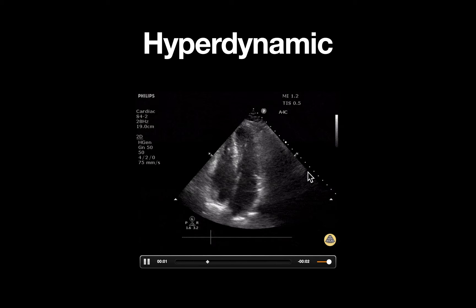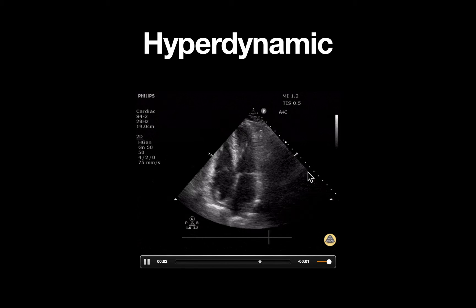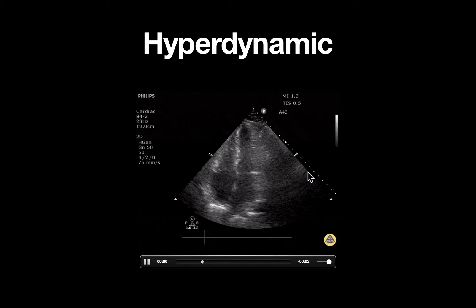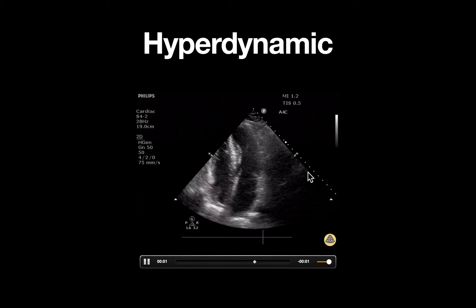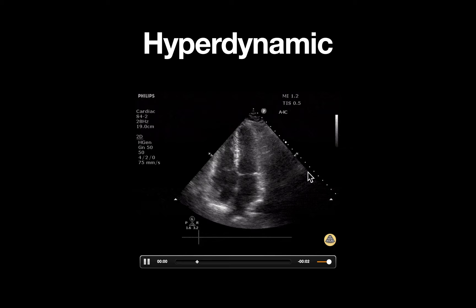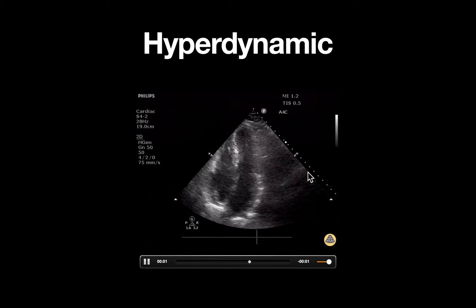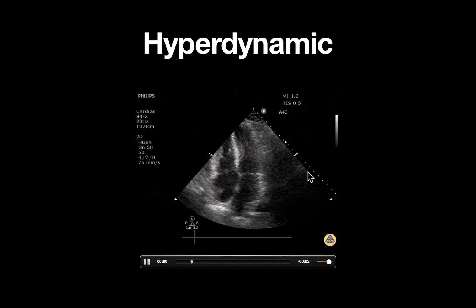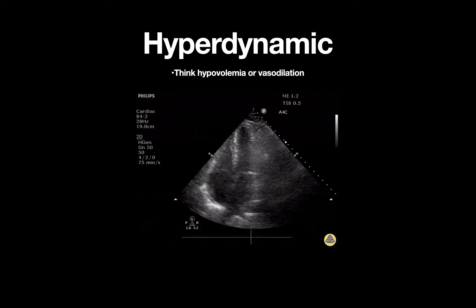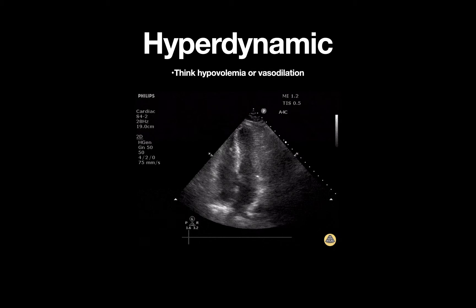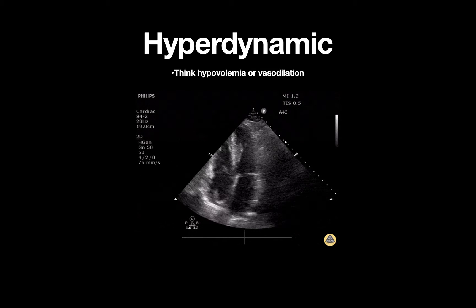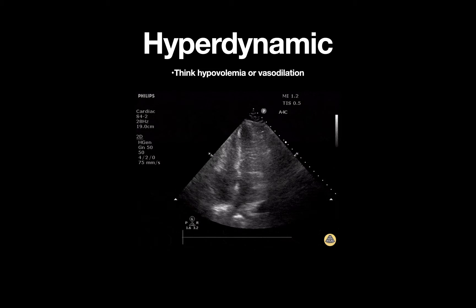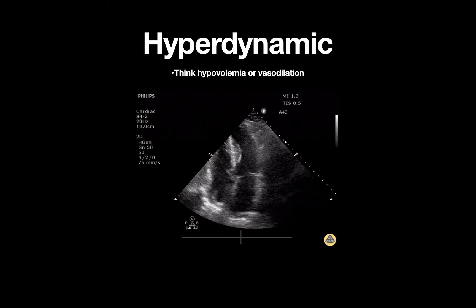Identification of a hyperdynamic left ventricle can be useful during assessment of acute unexplained hypotension or dyspnea, and can represent hypovolemia or peripheral vasodilation — in this case from sepsis.